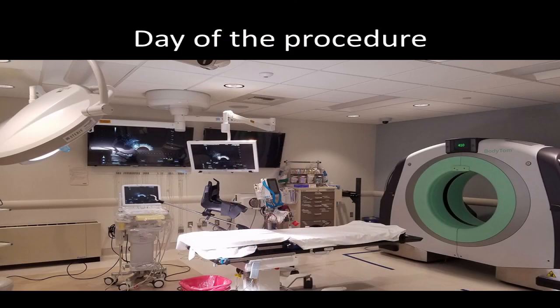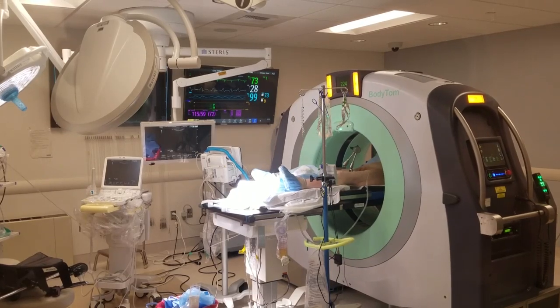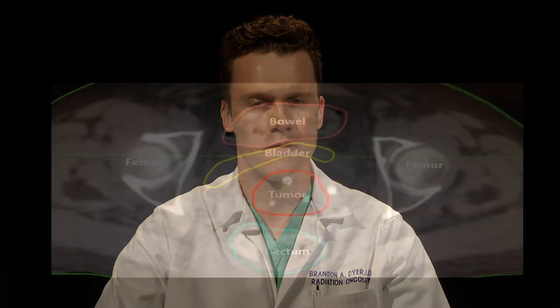After the applicator is placed for the brachytherapy, you will receive a CT or MRI scan, depending on your tumor type and the physician's preference, to best target your tumor. This scan is used to plan the delivery of radiation therapy. After the brachytherapy implantation and imaging, your physician will generate a custom plan to target and kill the tumor based on your unique individual anatomy.